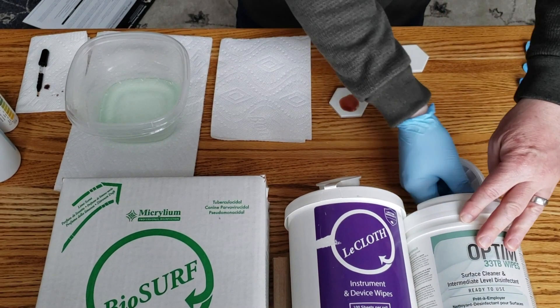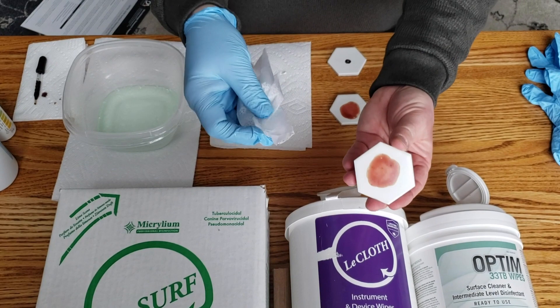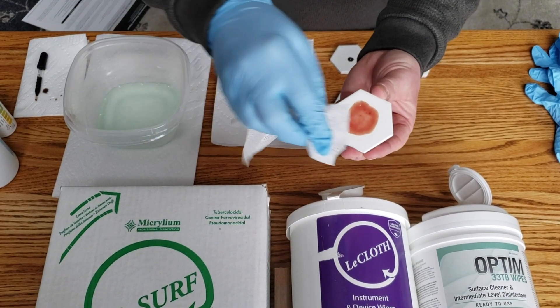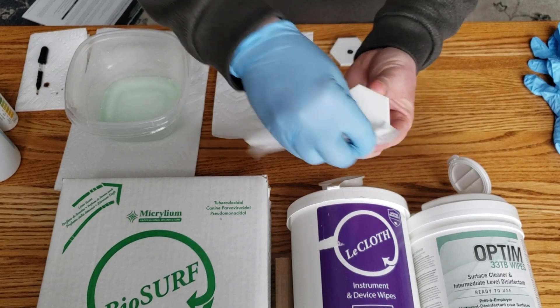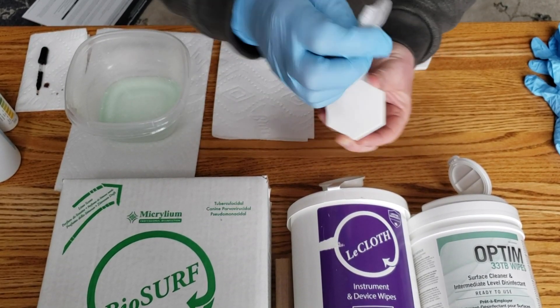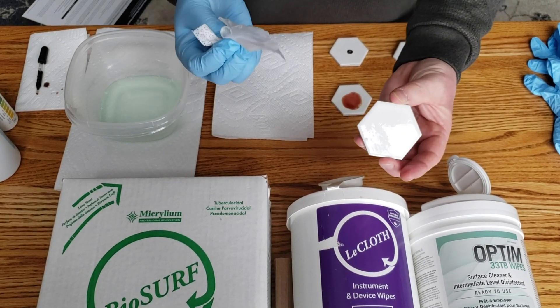Then I'll take a fresh wipe and wipe the dried sheep's blood — wiping for a five-second count. You can see I'm rotating the wipe so I'm not concentrating the blood.